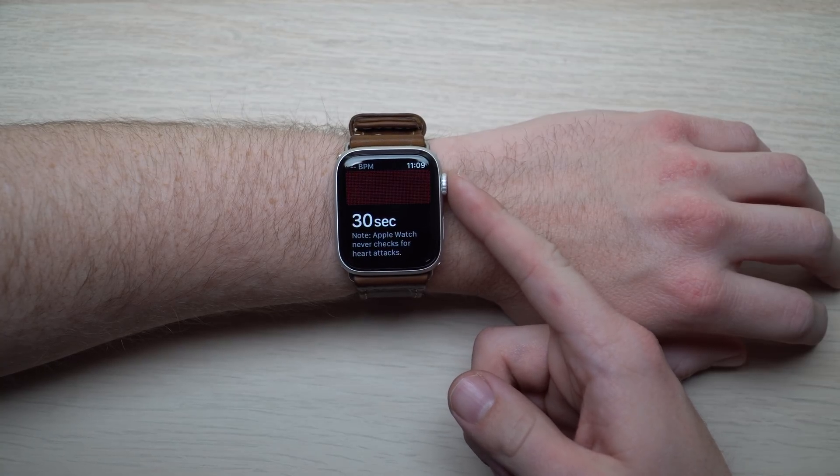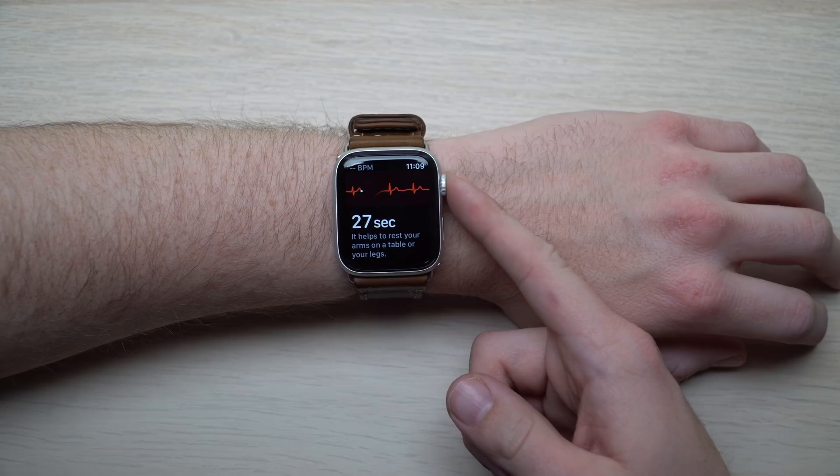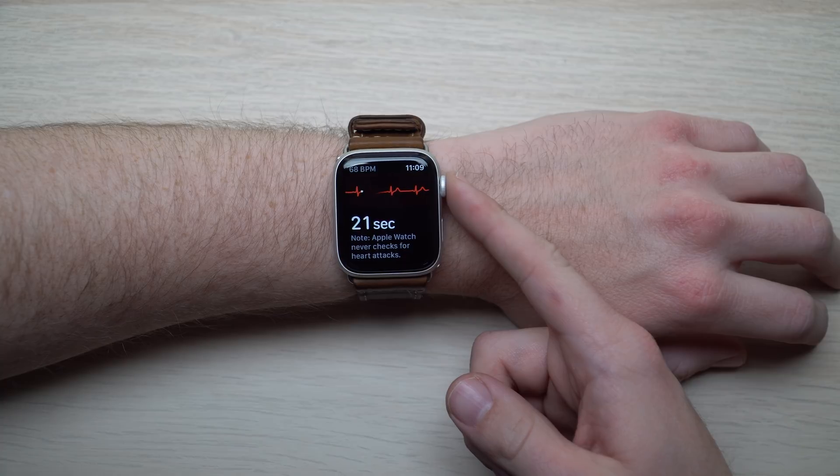You're going to want to hold your finger down for a full 30 seconds, but you're supposed to stay pretty much completely still while you're doing this test. Apple recommends that you sit down, maybe put your arm down on a table, or at best put your arm down on your lap and try not to make too much movement. Apparently if you make too much movement, it'll mess up the test and it won't be able to read your results correctly.